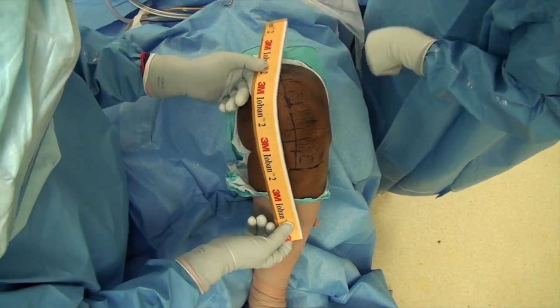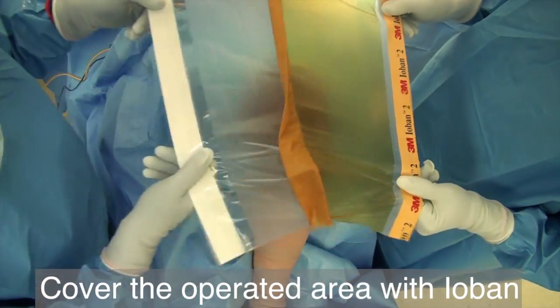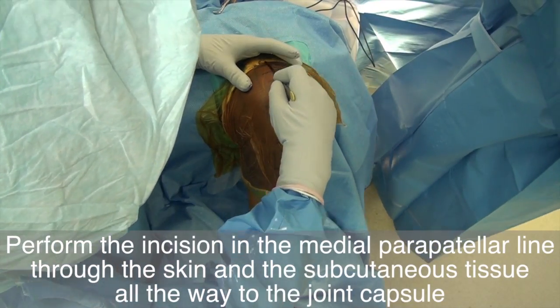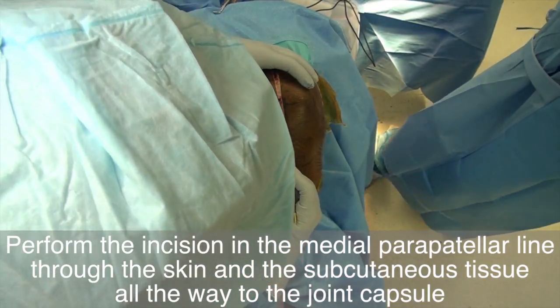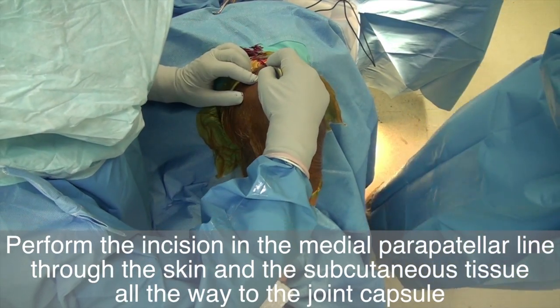Flex the knee back to 90 degrees and cover the operative area with Ioban foil. Carry the incision through the entire thickness of the skin in one smooth move. Then dissect the subcutaneous tissue until you reach the joint capsule.